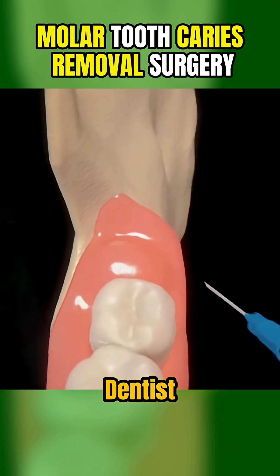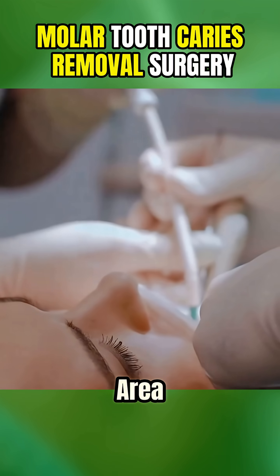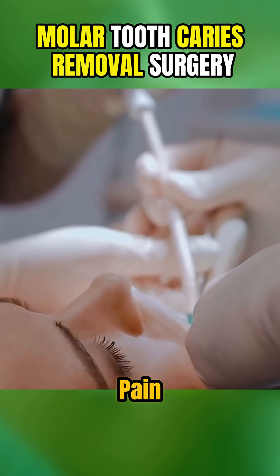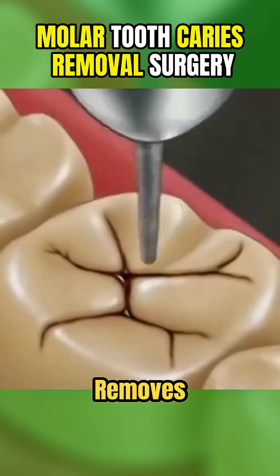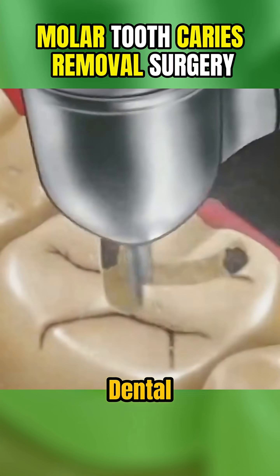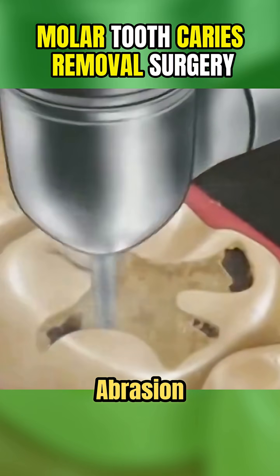First, the dentist gives a local anesthetic to numb the area so you don't feel any pain. Next, the dentist carefully removes the decayed portion using a dental drill, laser, or air abrasion tool.